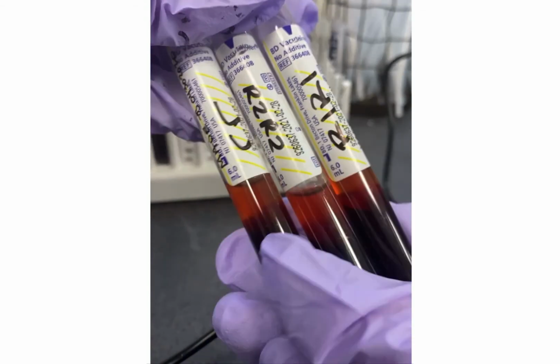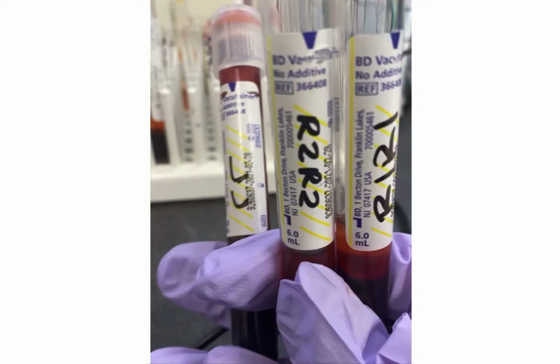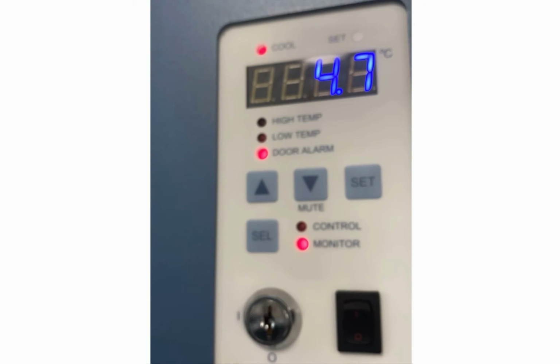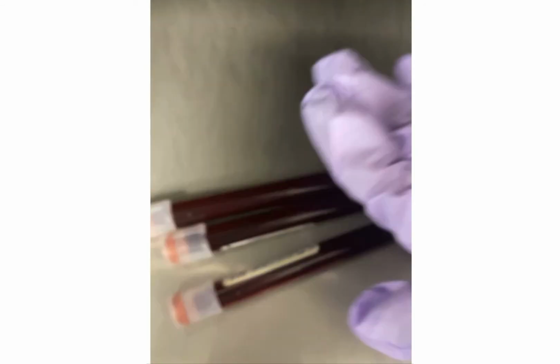I'll take these 3 cell lines and I'll mix them. Then I will take them either to the fridge, as shown in this video, or I can also take them to an incubator. Typically, I incubate for 30 minutes to 1 hour.